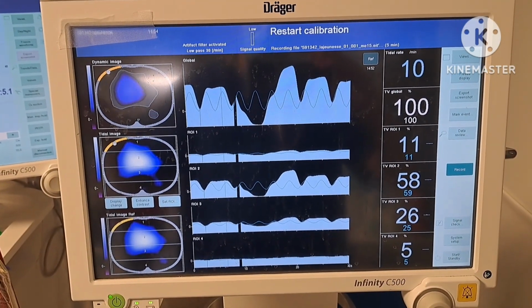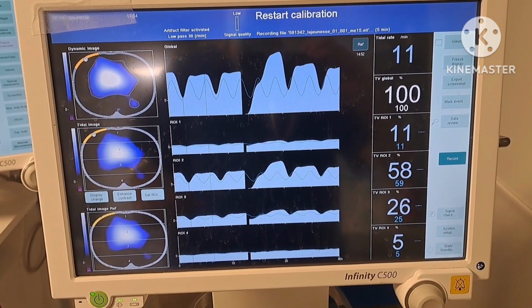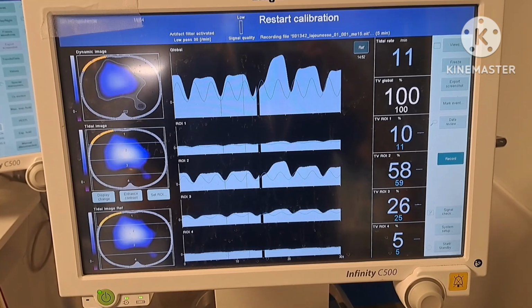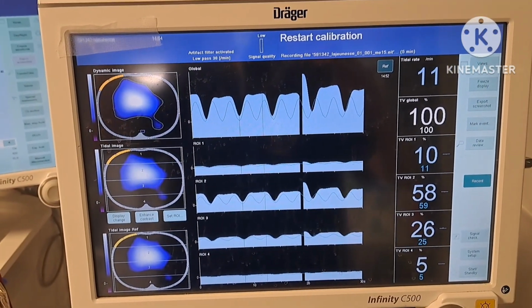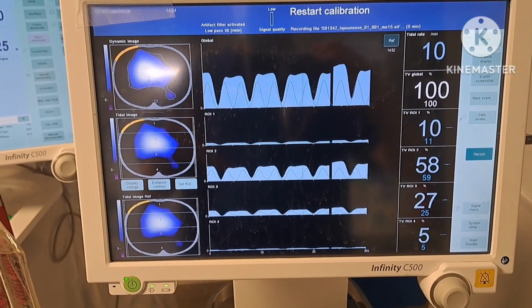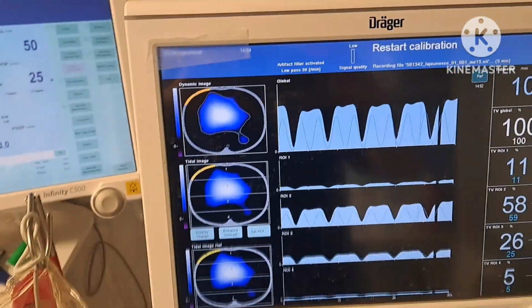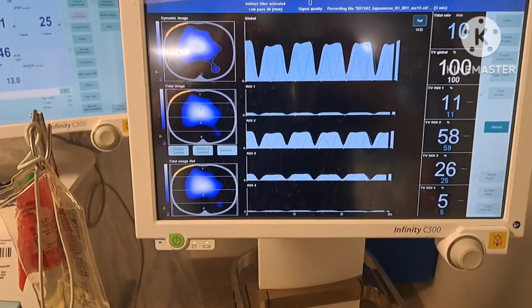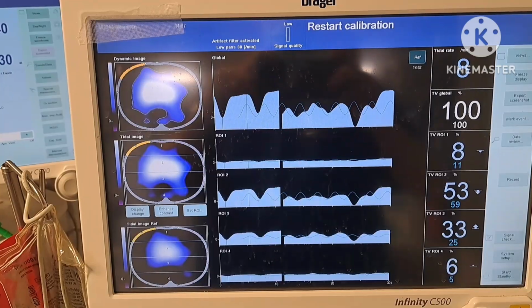We're starting at 25. I'm not going below that because that's what the plateau was on the previous mode. So I'm going to do 25, 26, 27. I'm going to jump right up to 30, and we're going to check if 30 is optimal. We have to open this up. Okay, so let's do that. I'm going to press pause and get right back at you very soon. Give me a sec, guys.